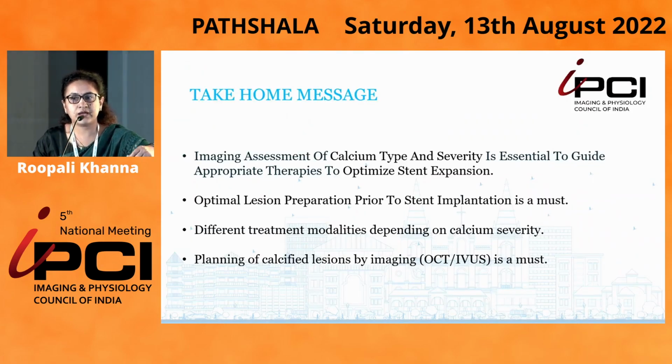In concluding my summary, imaging is helpful in assessing calcium, either the type or the severity, in guiding appropriate therapy to optimize stent expansion. Lesion preparation is a must prior to any stent implantation. There are different modalities depending on the calcium severity. No modality is better than the other; they go hand in hand and have to be used as adjunctive therapies. And planning of calcified lesions by imaging, either OCT or IVUS, is a must. Thank you.